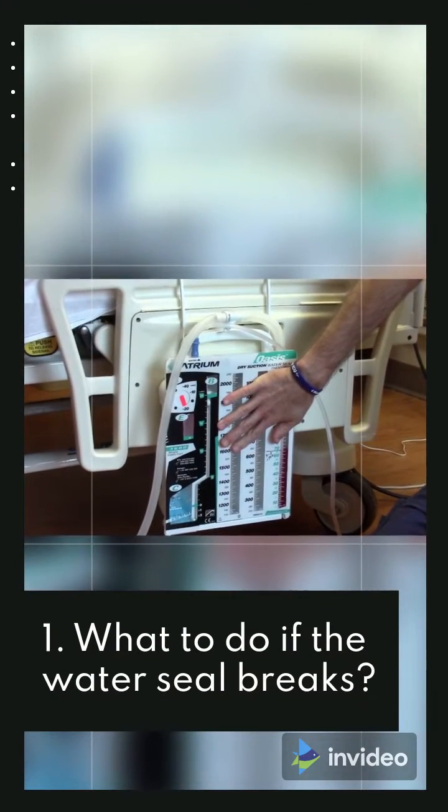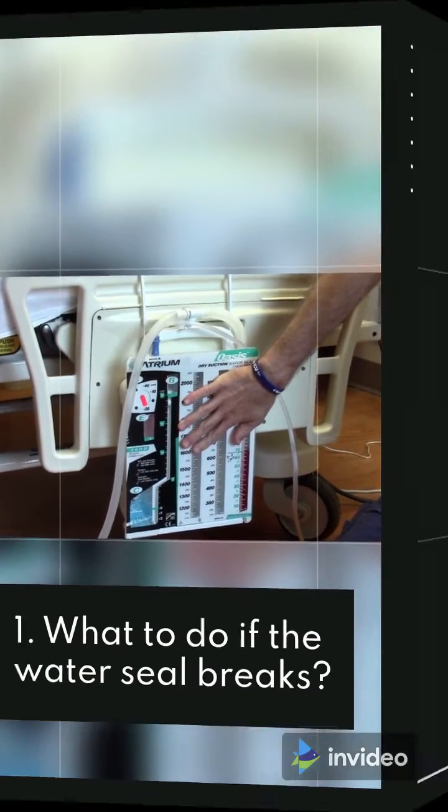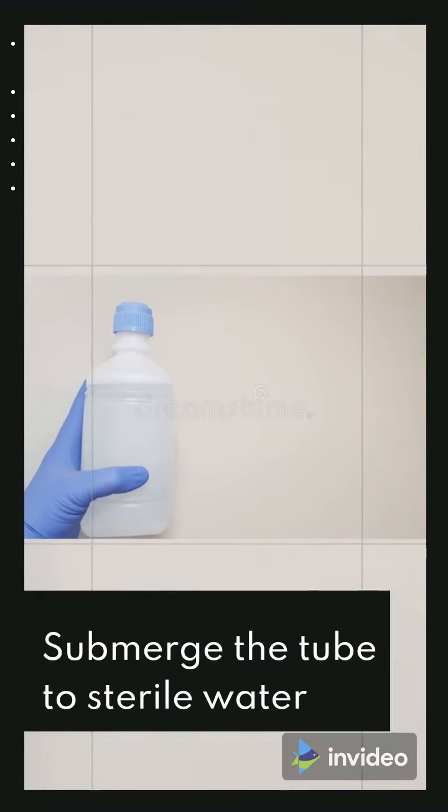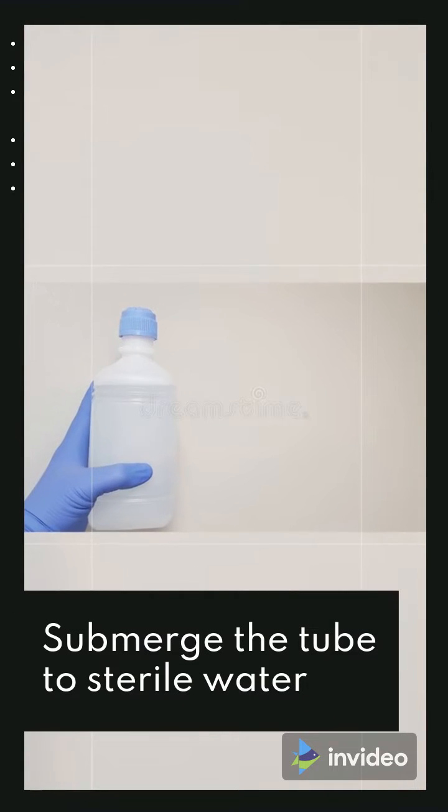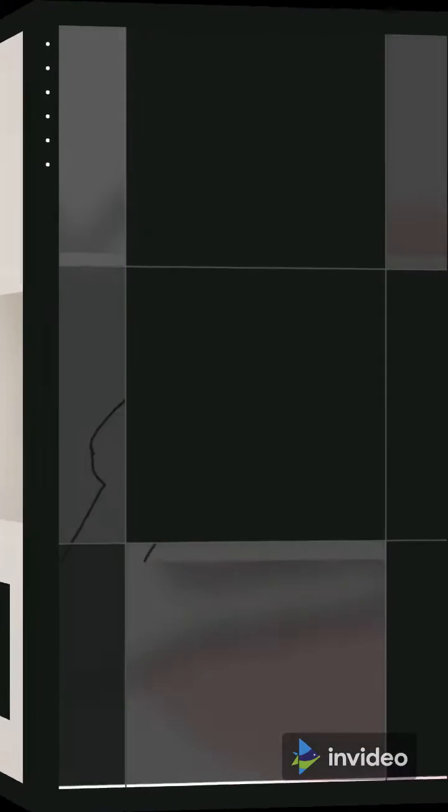What to do if the water seal breaks? Immediately submerge the tube in sterile water. If it is not available, clamp the tube for no longer than 15 seconds.